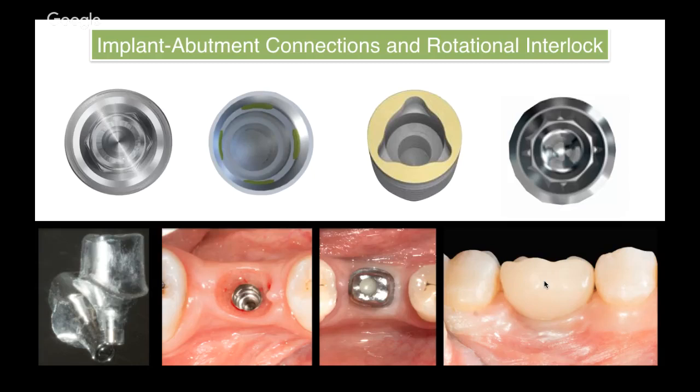Of course, this benefited prosthodontists more because we know today that this polygonal structure does not have a role in preserving the implant-abutment connection. So this polygonal structure helps us while transferring the abutment from the model to mouth and back. So for a prosthodontist, the minimal amount of angles would be sufficient. Let me explain this situation.